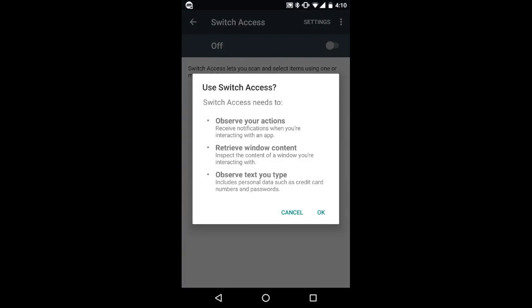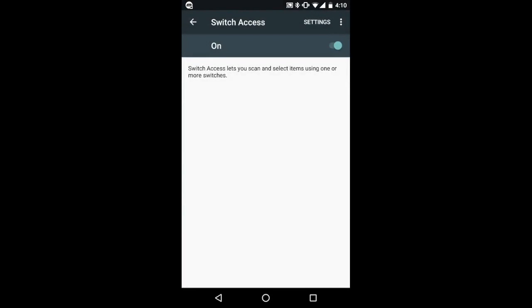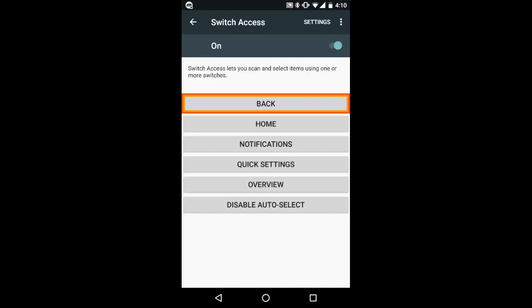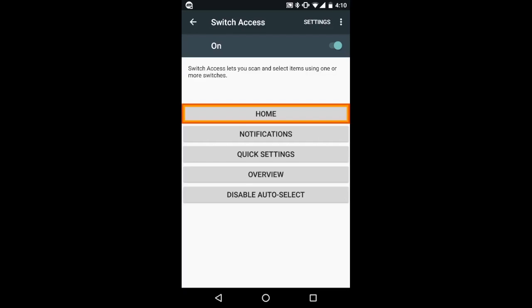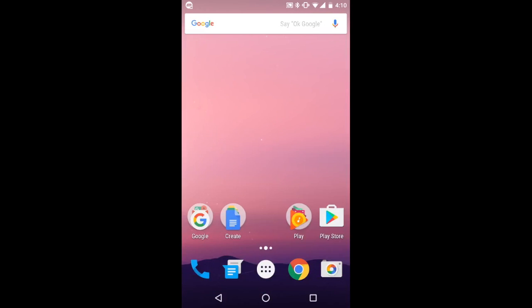And when the pop-up window appears, press the switch you want to assign to that function. You'll need to assign a switch to select and next for step scanning.